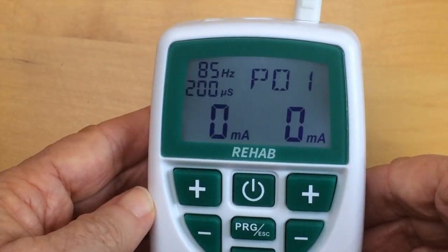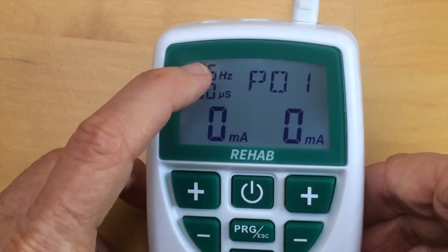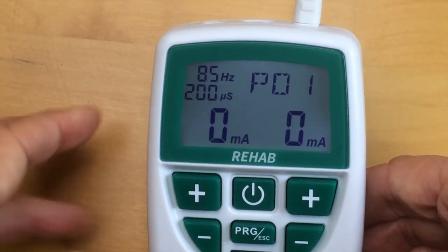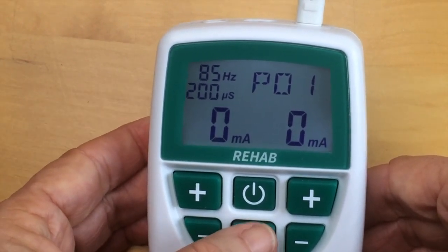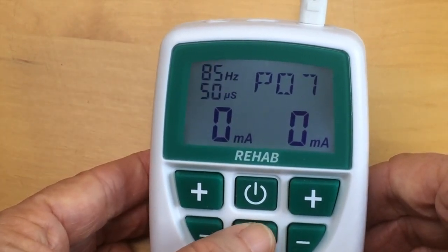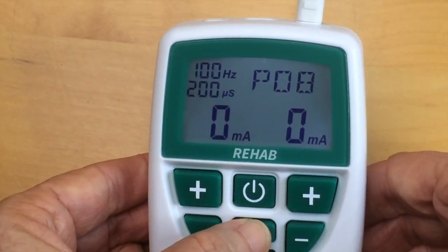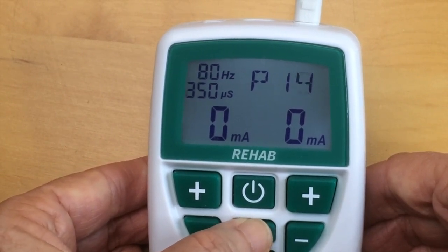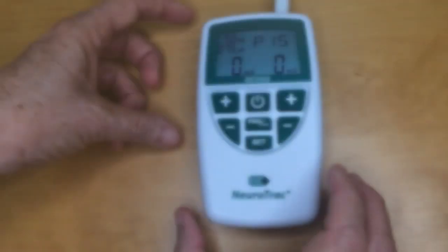Now I'm going to turn it on and you can see how the display lights up. I'm going to set the program now, which you can see in the top right hand corner. I use that program escape button — these are all presets, you can see the numbers changing on the left as well. Here I am at program 15, that's the customizable program for eStim.